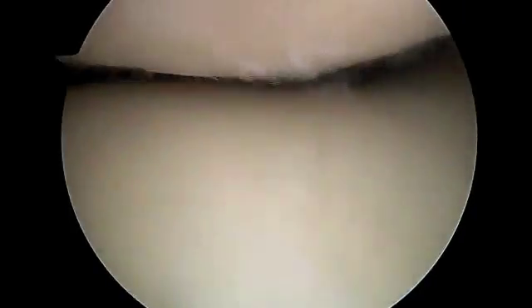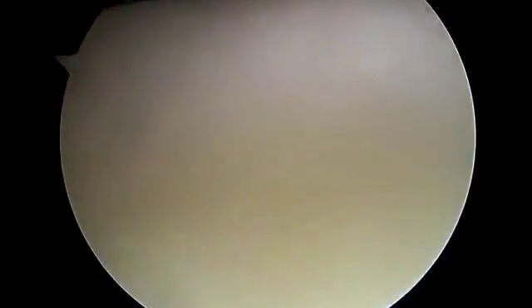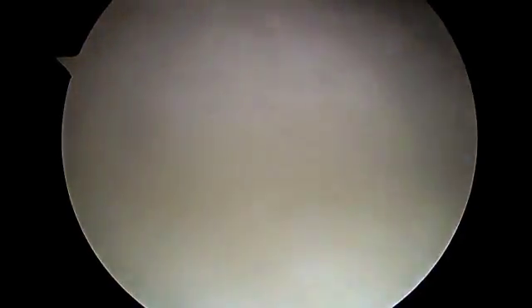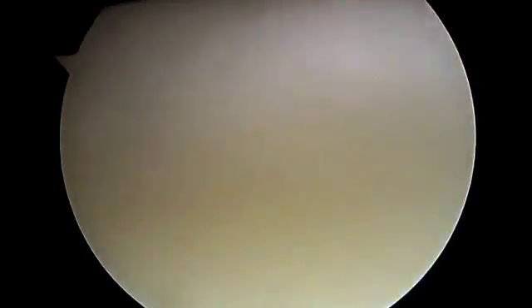Looking up now, this is the patella above. This is the trochlea, or the little groove the kneecap tracks in, below. You can see this articular cartilage, which is not in the weight-bearing portion, and it looks fairly good — no significant damage there. Nice, smooth articular surface. You can see where the kneecap tracks fairly well on the trochlea, and no significant damage to the surface at that point.